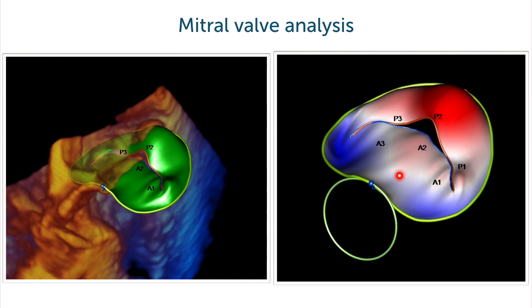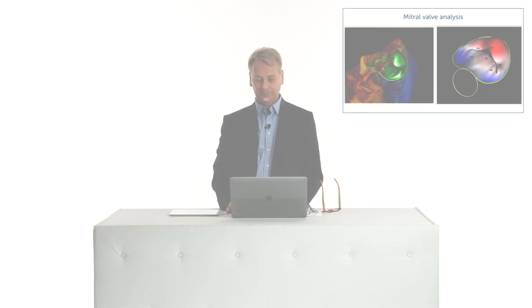Just another way of displaying this patient with a posterior prolapse shown in red and the remaining part of the leaflets in blue. This provides a very clear way of naming the structures, making it easy to understand these images and communicate them with the surgeon.